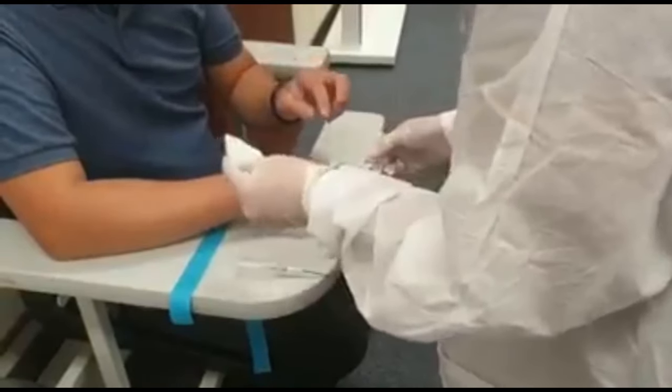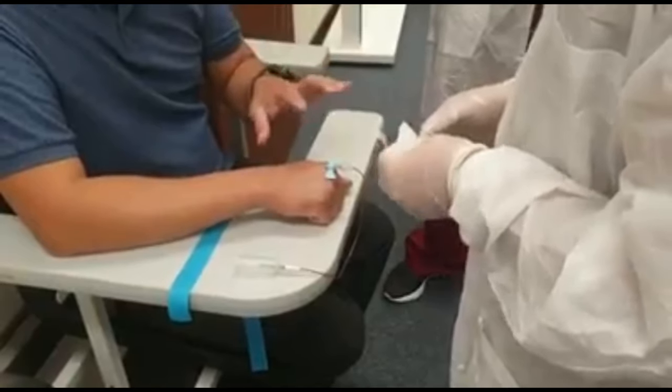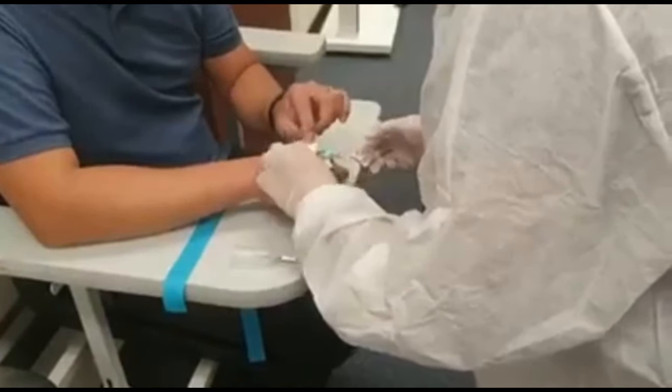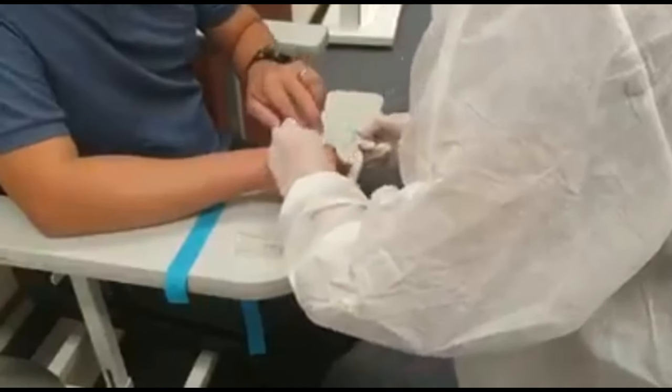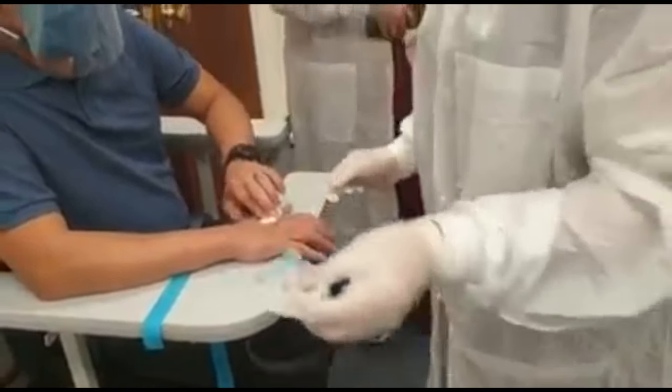In this case, since last week you did the pull-out method, for experience's sake I want you to press on the button. So go ahead and fold, hold it, cover the needle, and then push down. There you go, perfect. And then apply pressure. Nice. Instruct the patient to apply pressure.